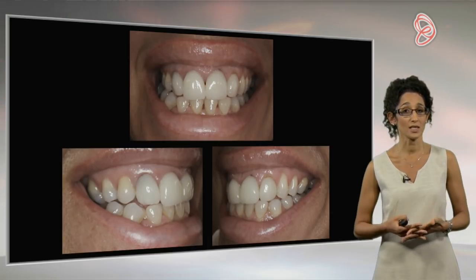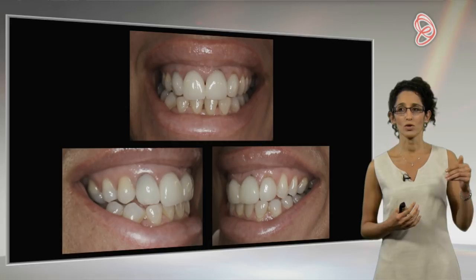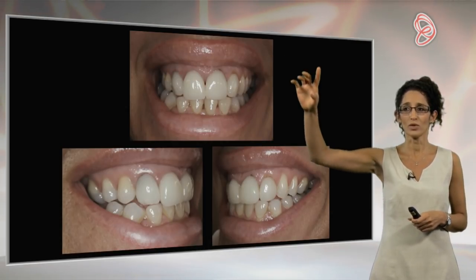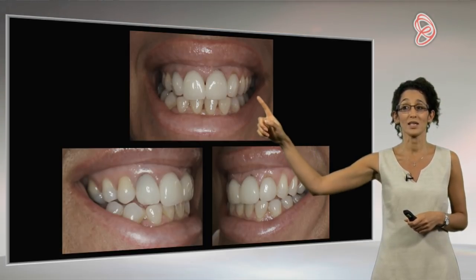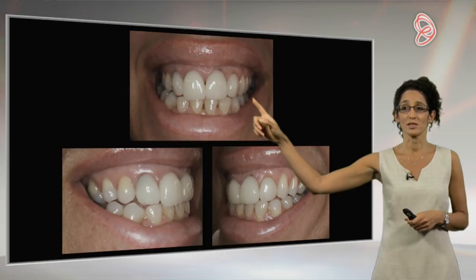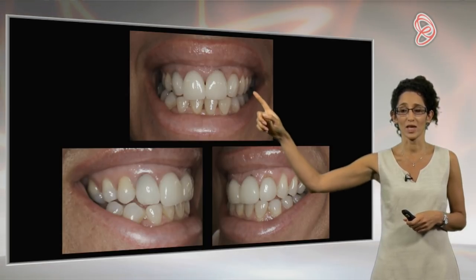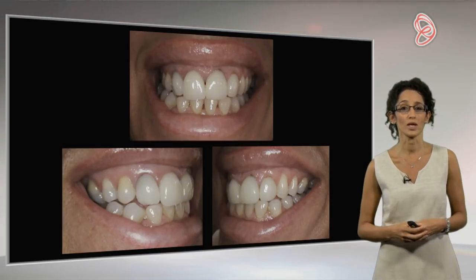So this lady was referred to me by her dentist. Now I just want to show you, you can see the top view over here, but if you look at this side, you'll see the canine is particularly long. So he'd suggested to me, Rana, could you see this patient and try and do a bit of grafting on this canine over here, and then we'll look at some gingival recontouring.